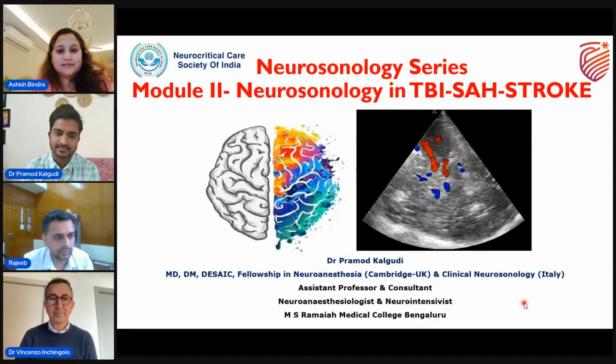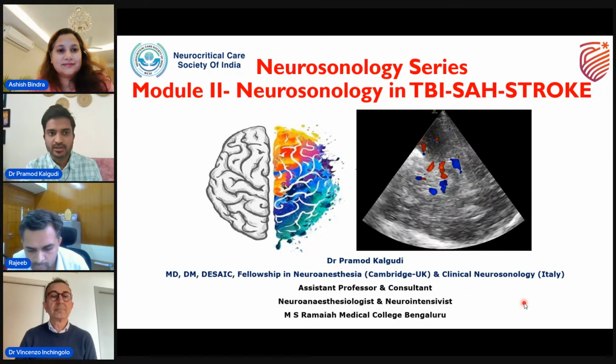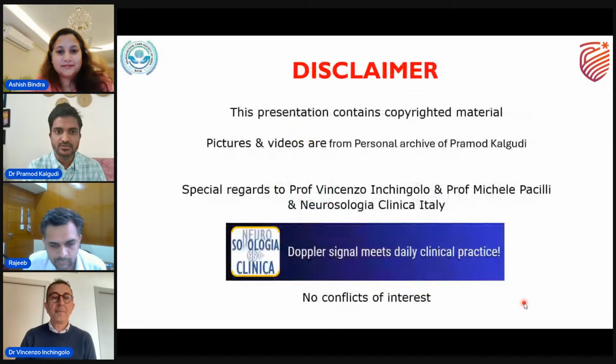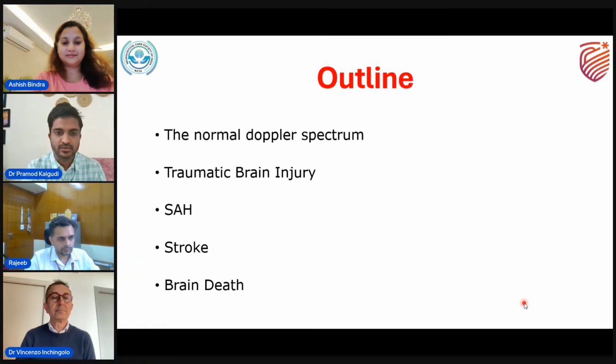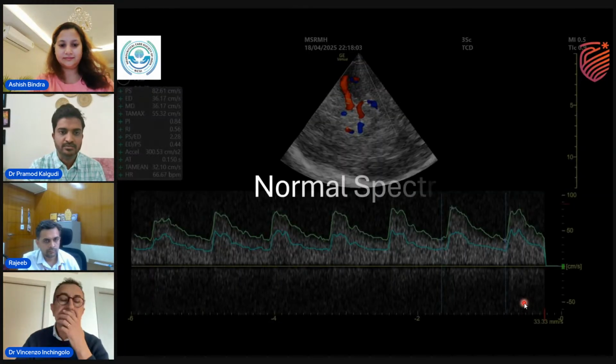Thank you, sir. Thank you for giving me this opportunity. So today we'll be talking about the use of neurosonology in TBI, stroke, and SAH patients. A short disclaimer: special regards to my teachers, Enzo and Michael, and I do not have any conflicts of interest. We'll start this session by looking at a normal Doppler spectrum, what the velocities are and how we measure them, and what the pulsatility index and resistive index are. Then we see how we utilize TCCD in traumatic brain injury, stroke, and subarachnoid hemorrhage patients.